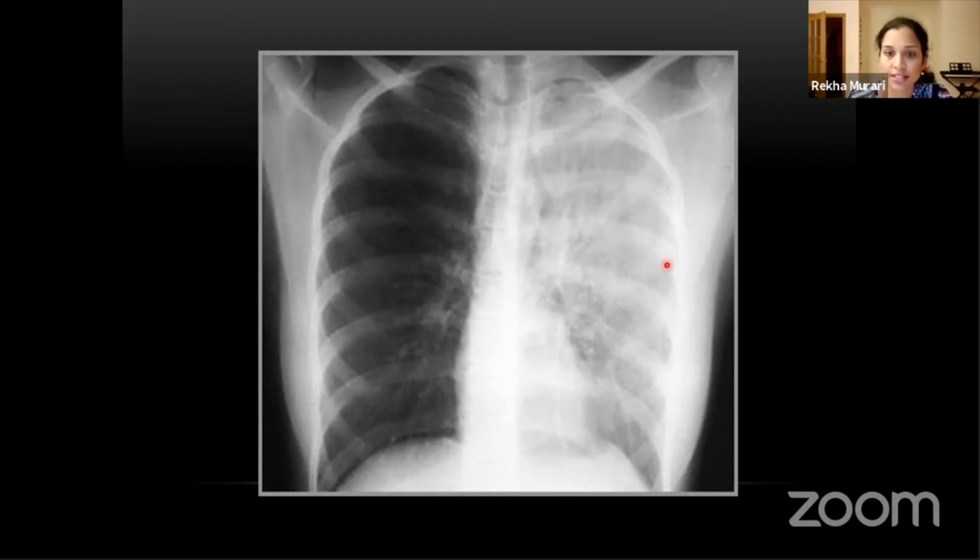So let's discuss this X-ray. I think you can all appreciate that this looks abnormal. Yes, some of you have said it's tension pneumothorax, left side too white. Hyperinflation and left whiteout. Yeah, whiteout. Yeah, well done. So first of all, you have to determine whether the abnormality is the right being too black or the left being too white. And if you see on the left, there are still lung markings, so it's not pneumothorax. So the abnormality actually is the left side, and it is the white lung, as a few of you have mentioned.